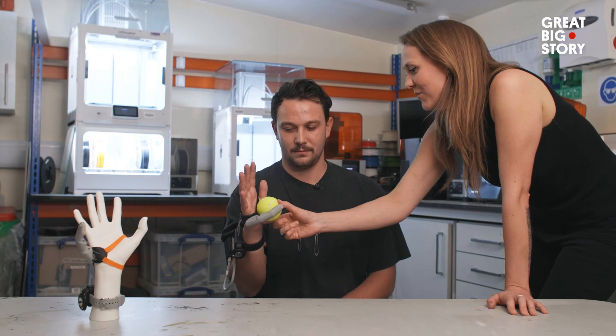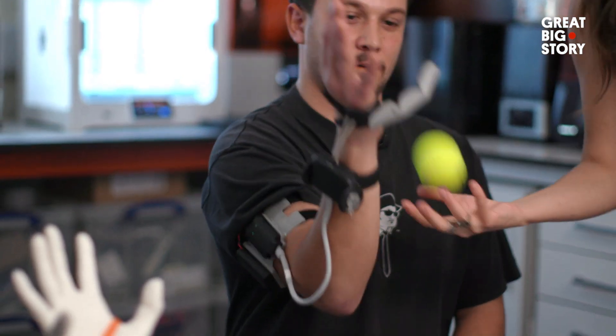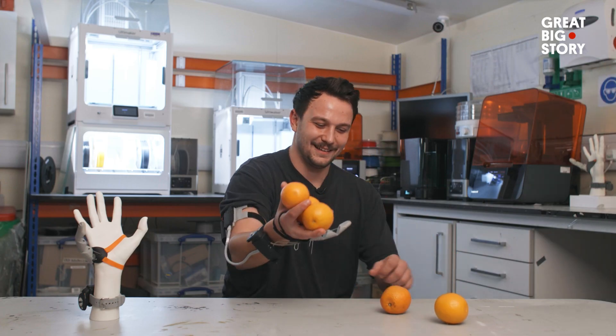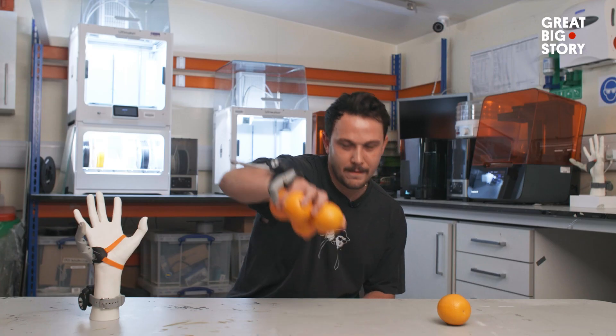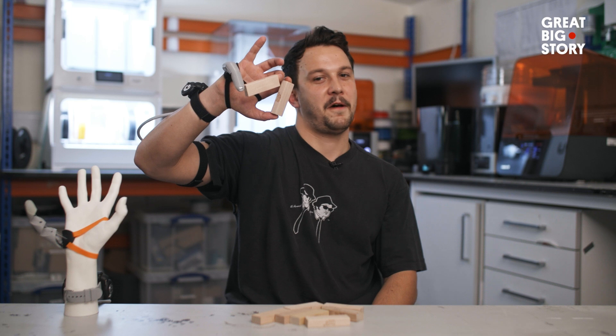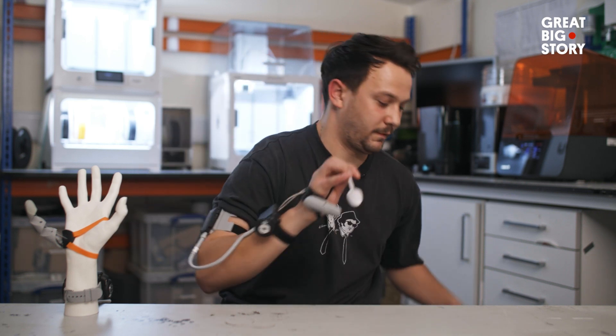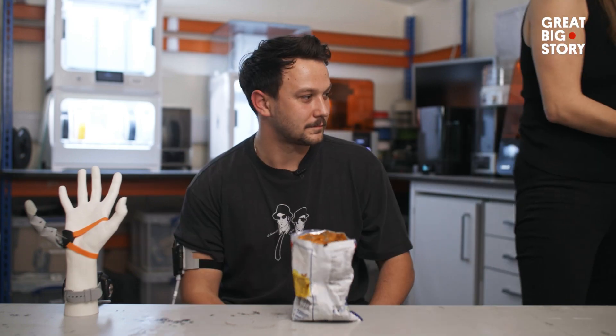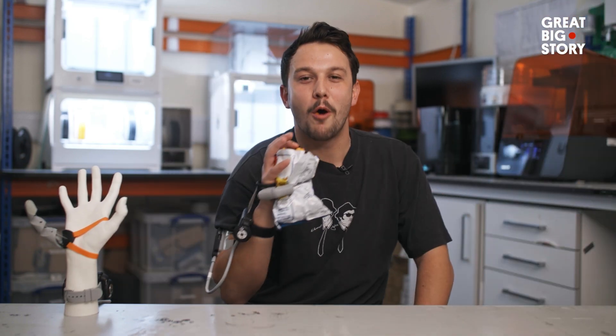Should we give you your first object? I'd love to. Okay, press and hold. How many oranges can you normally pick up? I can hold three oranges in my hand normally — four oranges with the Third Thumb! Should I take a drink? It's delicious.